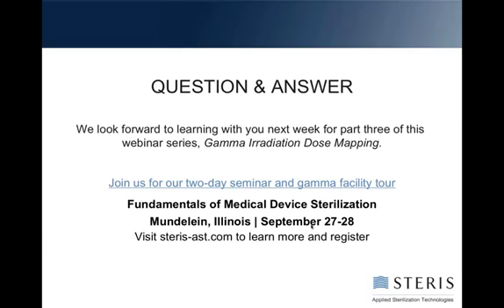Rule of thumb, most people are going to start at about 1.6, so that's where the 25 to 40 comes from. You can test multiple doses to see if you're not required to take it to failure, but sometimes you want to know a dose at least a bit higher than you plan to use because, and whoever asked the previous question, perfect timing, there might be times when you need to augment your dose. If you've run product at 25 to 40 and used most of that dose range, you may not have any dose left in that range to augment, but say you tested to 50, but you only run 25 to 40, you've got that extra 10 kilograys of reserve.